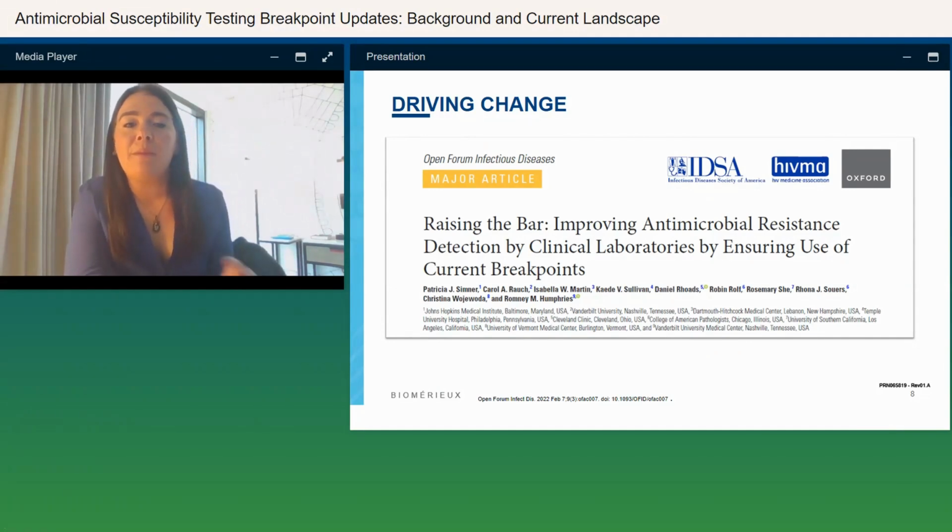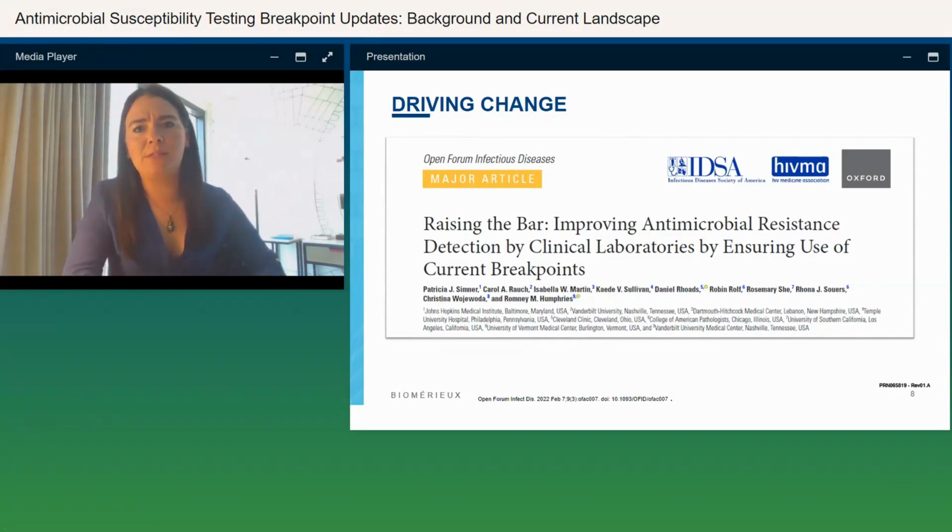challenge. What happened here was individuals from the College of American Pathologists, or CAP, had noticed that when laboratories were sending in the results from routine proficiency surveys, which if you've worked in a clinical lab or if you're in a lab now, you routinely get to test proficiency, it seemed many labs were perhaps using obsolete breakpoints on their antimicrobial susceptibility test methods.